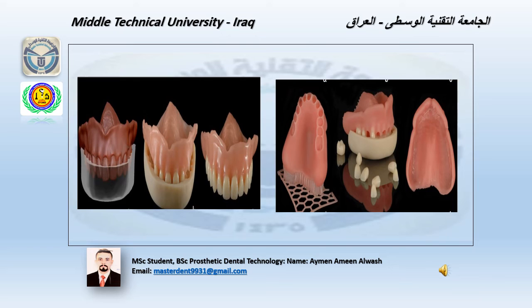بعدين we put the transfer key on the denture base and apply pressure properly. After that we put the complete denture under pressure about 2.5 bar and 40 centigrade temperature for about 20 minutes.